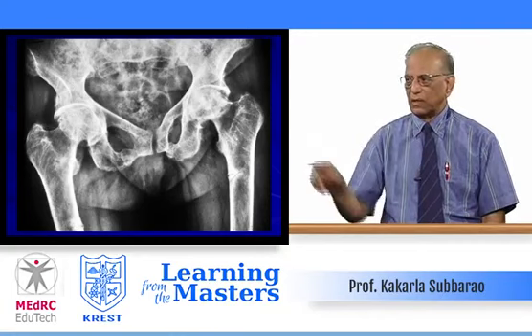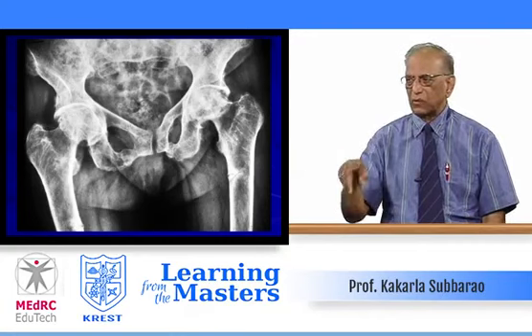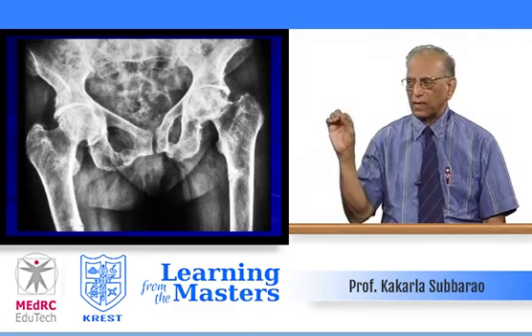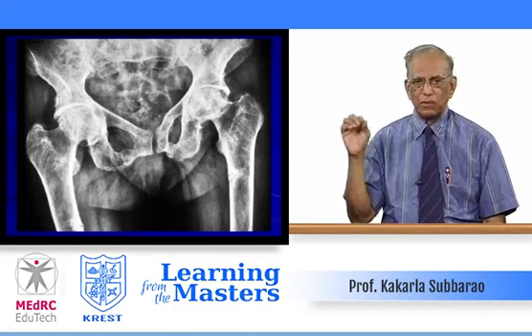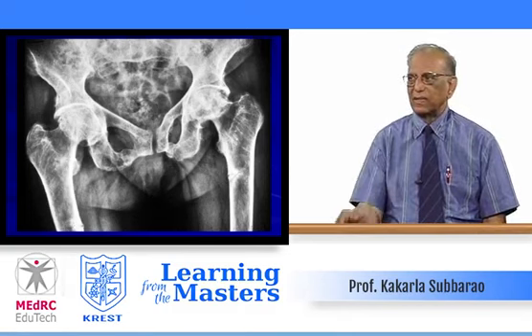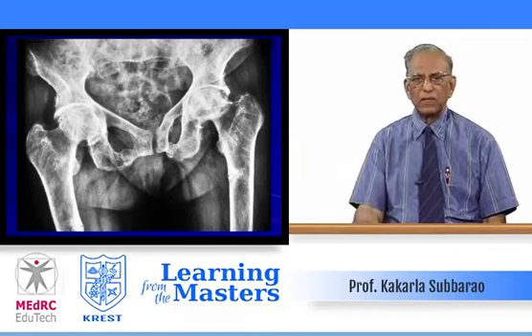are healed. And if you look into the femoral shafts, both on the right and left, there are Looser zones. And they are attempting to heal up spontaneously. That's why there is increased density, and the trabecular pattern is exaggerated. This is a typical picture of osteomalacia.